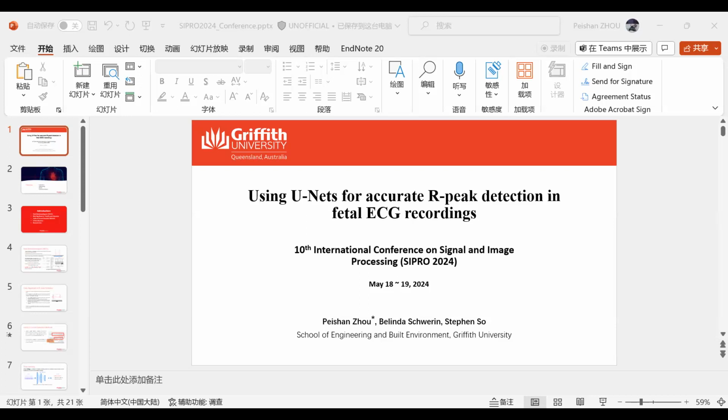But for the fetal ECG signals, it's quite difficult to catch clear features of the 3 or some of them, because the non-invasive fetal ECG signal is a mixture of the maternal ECG and different types of noise we can see here. So the fetal ECG is obtained by canceling the maternal ECG first and then removing the rest of the noise. And by doing that, the extracted fetal ECG is always quite weak and has really low SNR levels, and also may have morphology distortion.